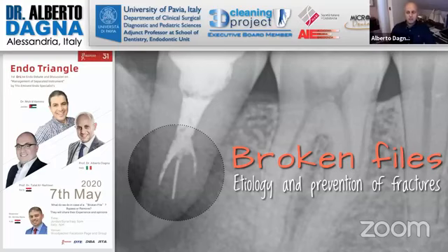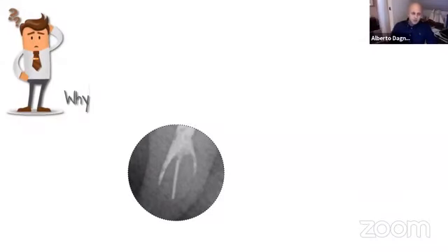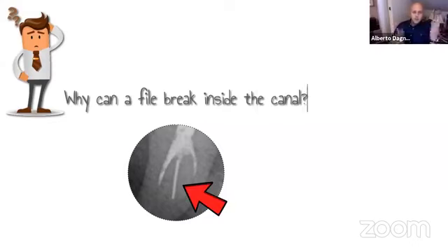the causes and the etiology of the fracture of a file inside the root canal, and we'll discuss the strategies to prevent the fracture of a file inside the root canal. The first question is why we can break a file inside the canal.